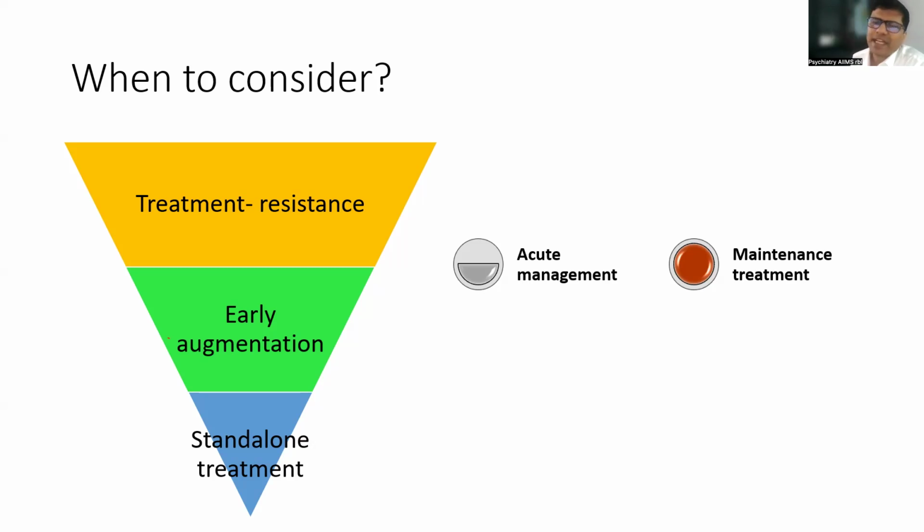They have severe intolerance to serotonergic medications. So they were not able to tolerate the medications. We cannot optimize the dose of medications. So we started with rTMS. During the acute phase of treatment, the symptoms are adequately controlled. But the after effect of TMS after multiple sessions usually wears off over a period of 8 to 12 weeks. So we require maintenance treatment for the continuous control of those symptoms. So these are the conditions where you can consider it as a standalone treatment.